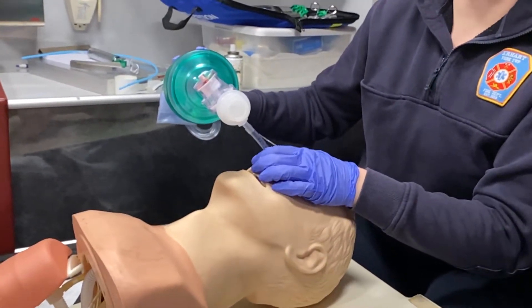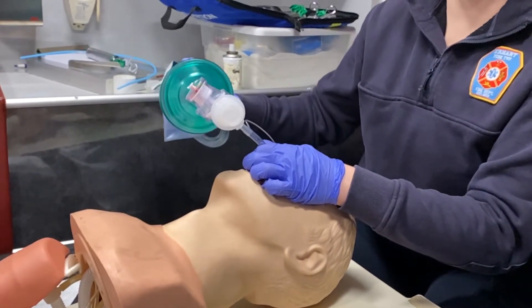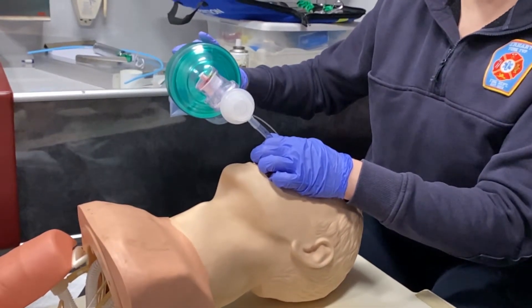And of course, put on your waveform capnography, because that is a hundred percent telltale if you do have a good airway. You would ventilate once every six seconds, just like a regular intubation.